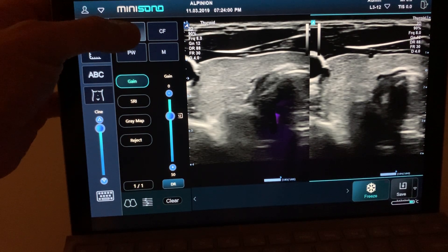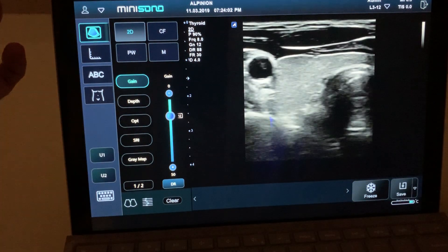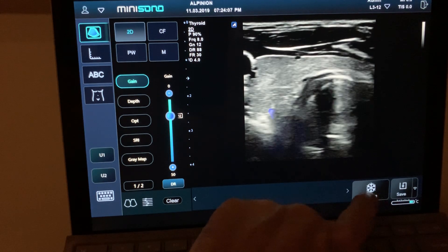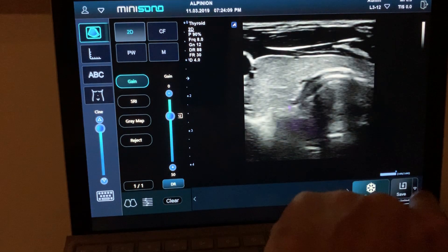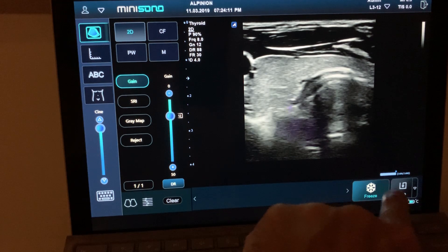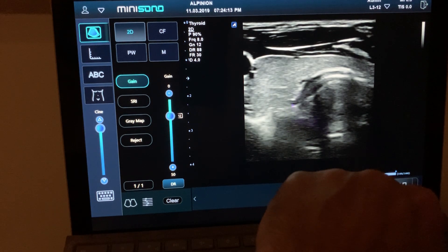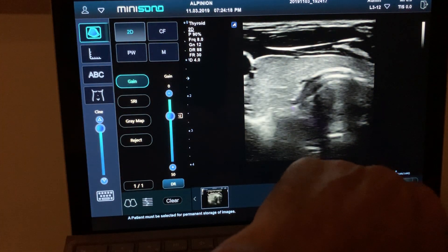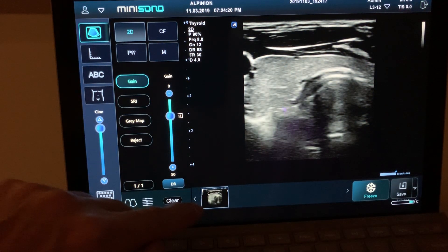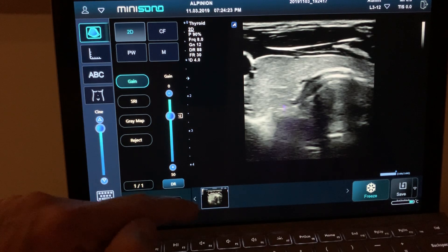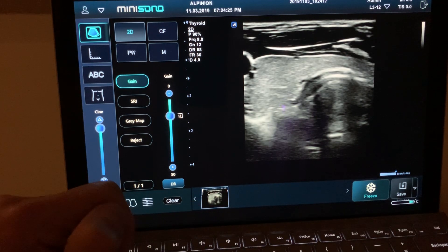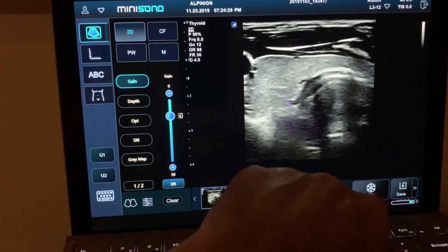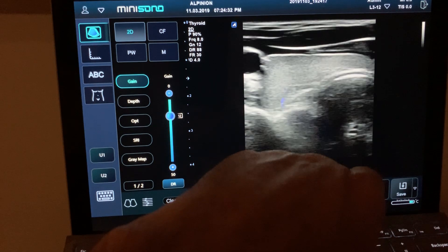When you have an image and want to save it, the save button is in the right lower corner of the monitor. When you click there the machine will save the picture, and you'll see a little icon that tells you the picture has been saved. To go live again, just unfreeze the machine and you're scanning again.